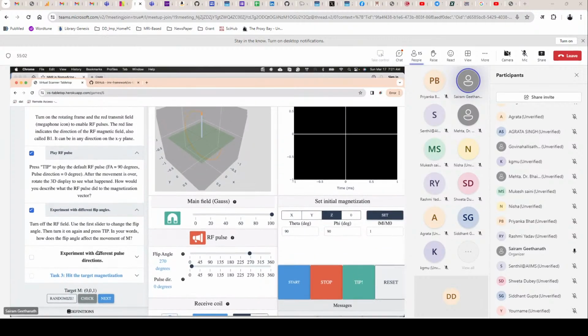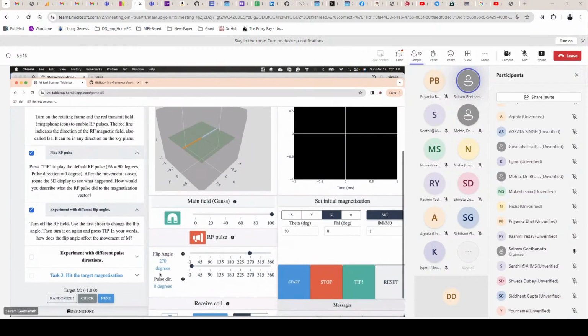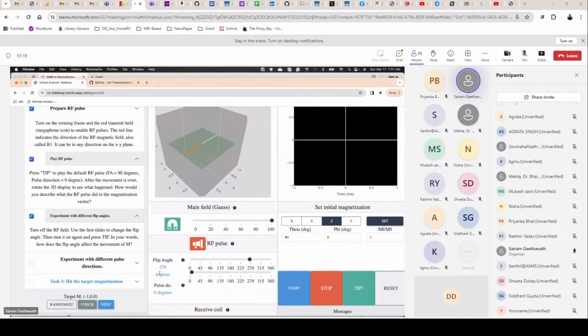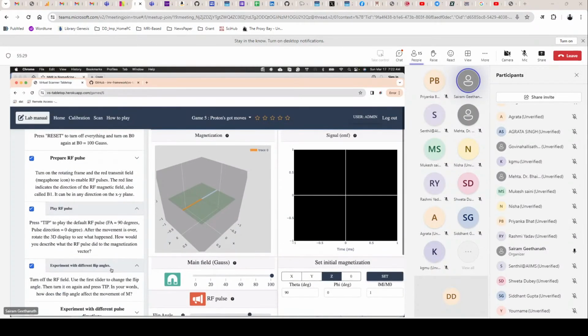But you could imagine different versions where you randomize the exercise, and you keep getting new initial and final magnetization vector positions. Based on your knowledge of the RF pulse and how you want to play it, you want to get that back. I think Geva says in about 3 moves. It depends on your understanding whether you can do it in 3 or fewer. But that's the general sense of the game.